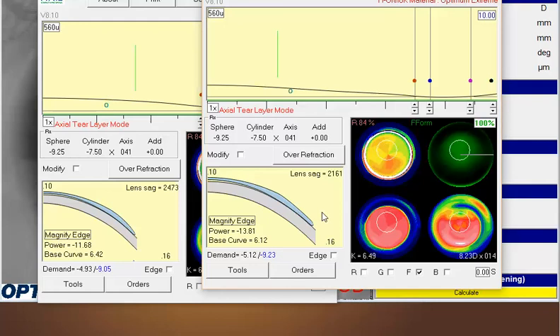And actually, most of my complicated corneas, I like to put a spherical RGP lens on the eye of known parameters and use that little power adjustment tool to see. And quite often you'll see that wave is right on with the calculation. And other times you'll find it changes the power of the lens a little bit here and there, and that can be very helpful, especially if you're dealing with monovision patients, or someone who needs a little more particular accuracy in the refraction.